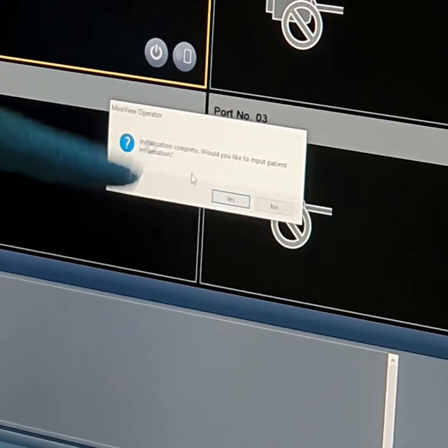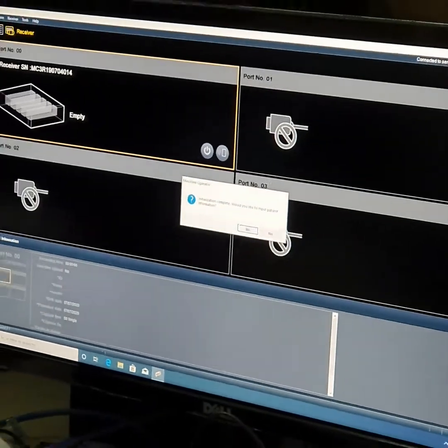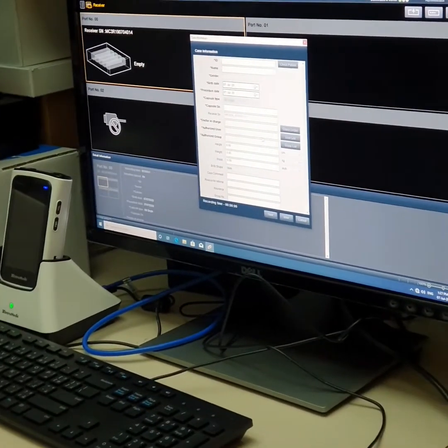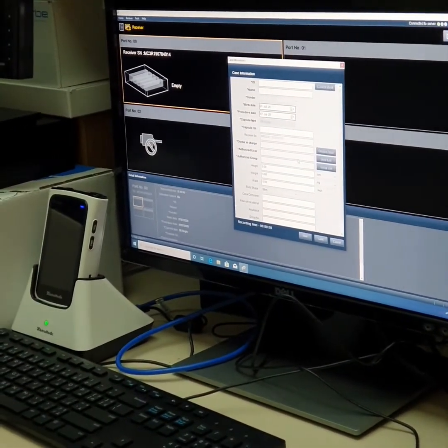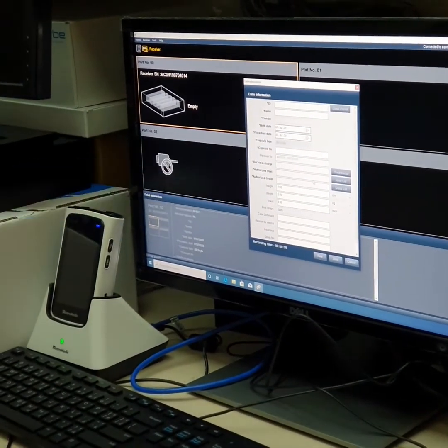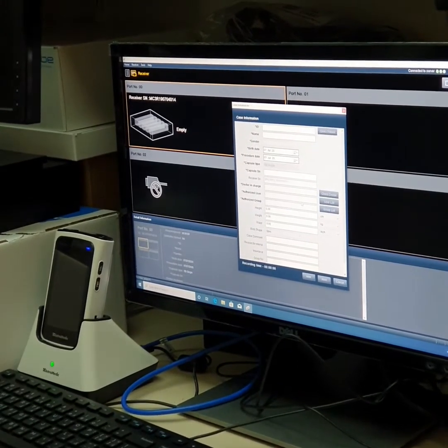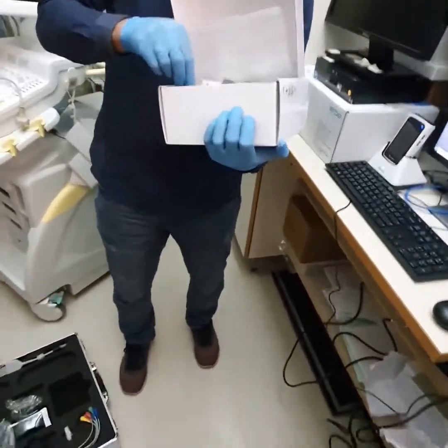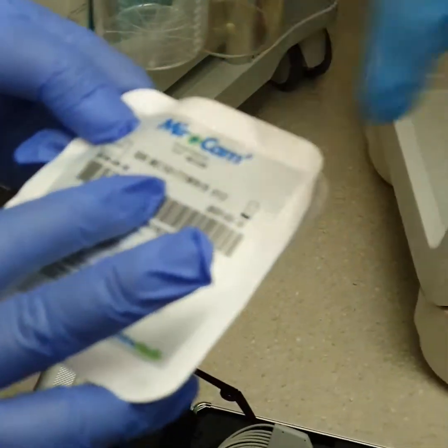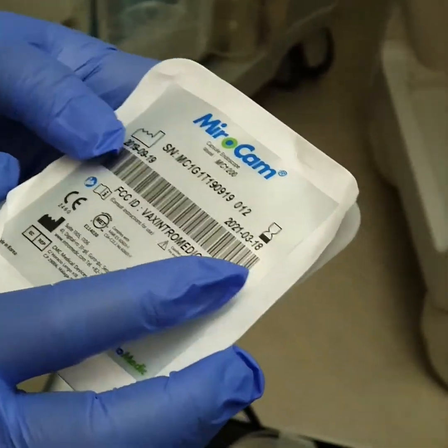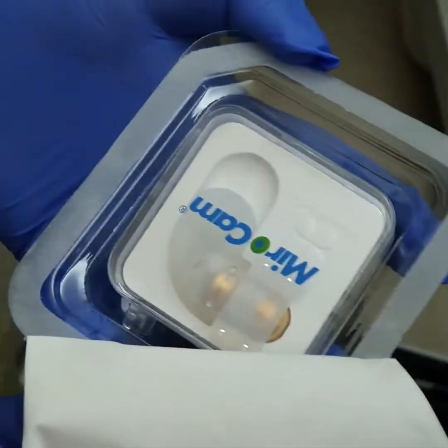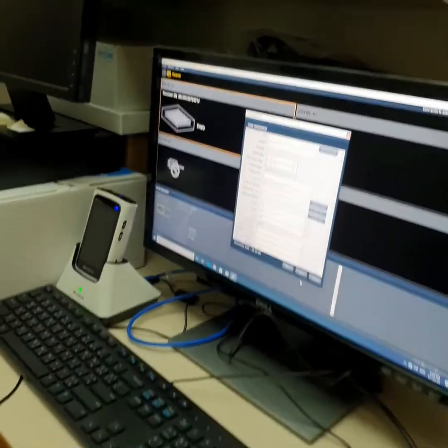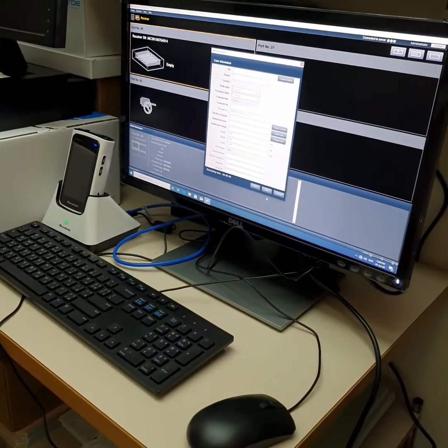It asks: would you like to input patient information? Suppose yes — I have a patient. If I say yes, it will give me fields for patient information. I fill them according to the patient data — birth name, and so on. The most important part in this field is the serial number of the capsule, which I get from the box.